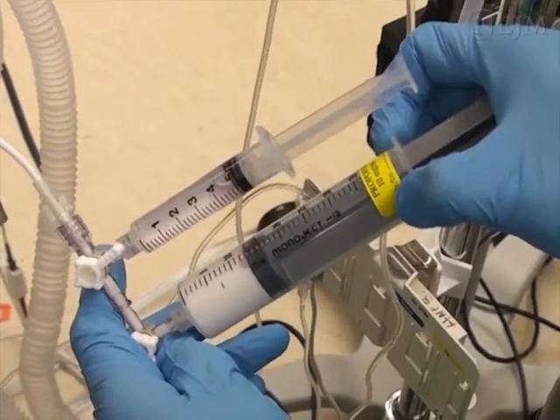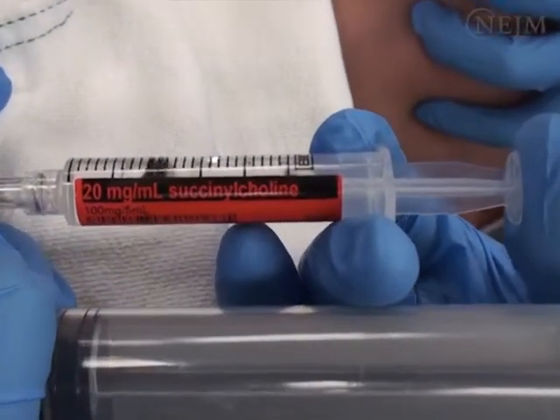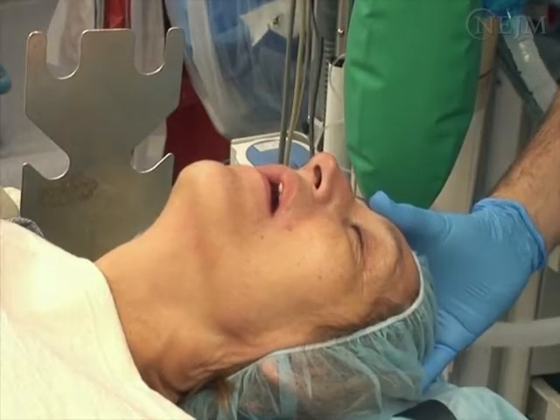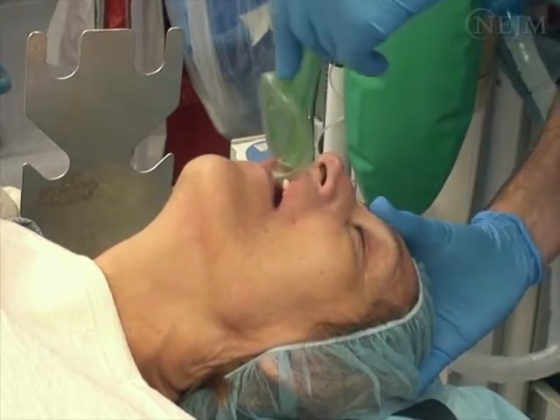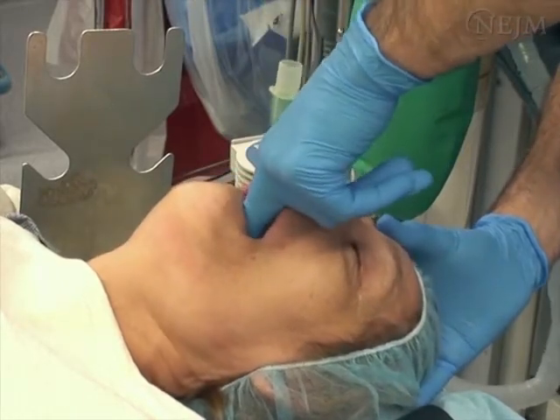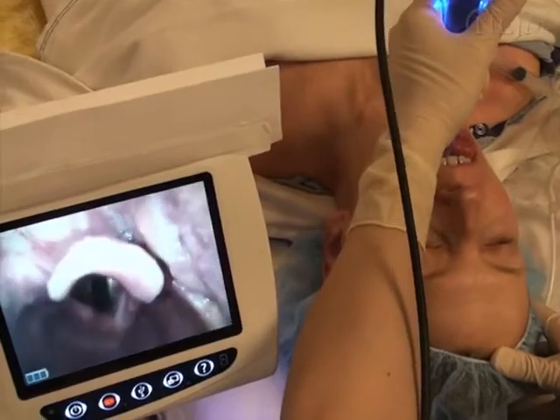A laryngoscope, endotracheal tubes, and stylets should be available in case immediate reintubation of the trachea is necessary. An induction agent, such as propofol, and a muscle relaxant, such as succinylcholine, may facilitate emergency reintubation. Some experts recommend having other advanced airway tools on hand before performing endotracheal extubation. These include supraglottic rescue devices, airway exchange catheters, and a video laryngoscope.